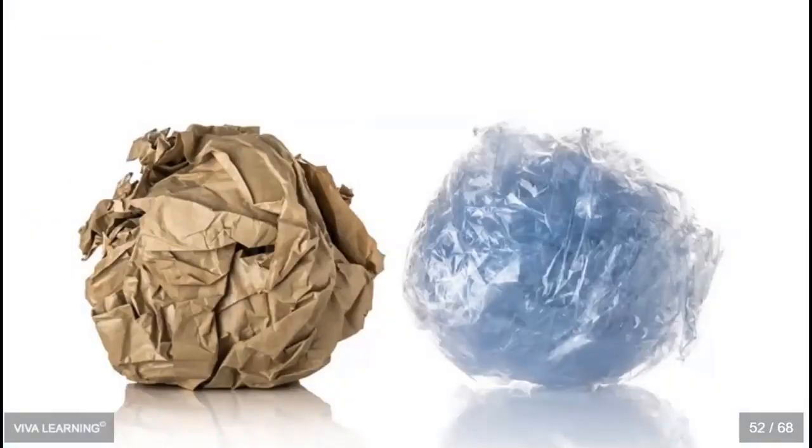We're going to switch now to a little bit of the packaging part of sterilization, and this is the age-old question, paper or plastic? And which side goes up? And the answer is neither. Best practice as recommended by sterilizer manufacturers, instrument manufacturers, packaging manufacturers is that the pouches or packs should be positioned vertically on a rack, almost like books on a shelf. And there should be space in between each pouch or pack to allow for 360-degree circulation of the sterilant.